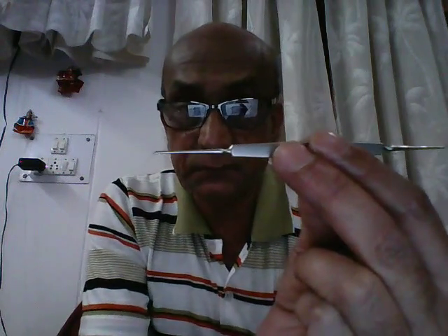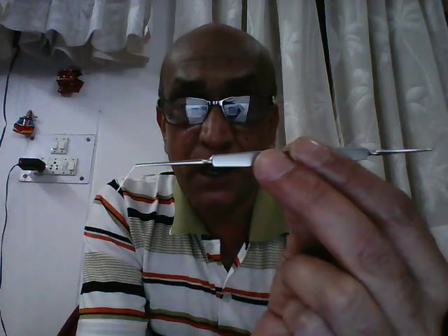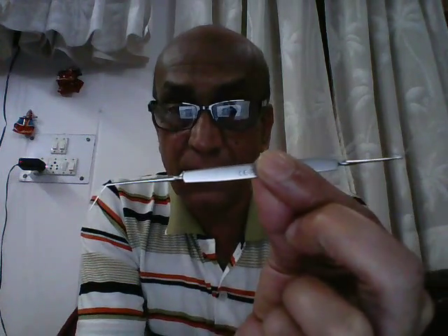This instrument, which I am holding in my hand right now, is referred to as the dust tool, iris and pupil repositor. The middle portion of the instrument is the stem which I am holding between my fingers. However, the two ends have got different functions. Let's take a look at each end one by one.